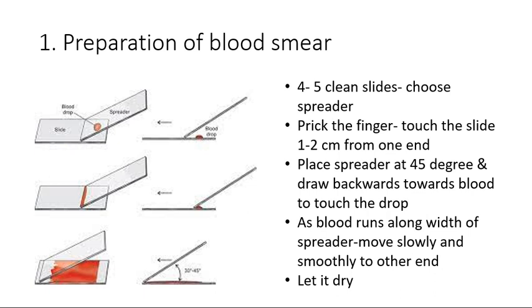Touch the slide 1 to 2 centimeter from one end. Okay, you don't have to touch the finger. In fact, you have to touch the slide. Okay, 1 to 2 centimeter away toward one end only, as shown in the image. Okay, then place the spreader at 45-degree angle.